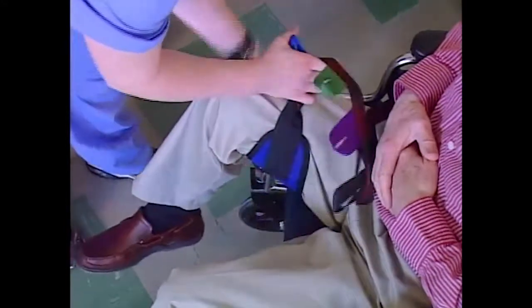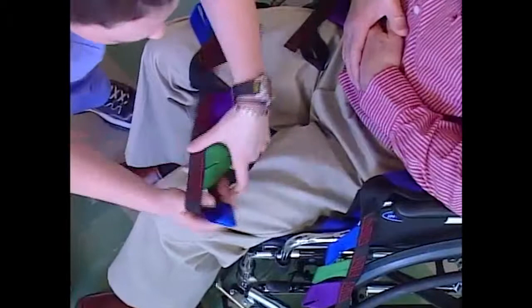Pull the thigh support until it reaches completely around the patient's thigh. Do the same for the other leg. Be sure that the sling is clear of the wheelchair's front corners.